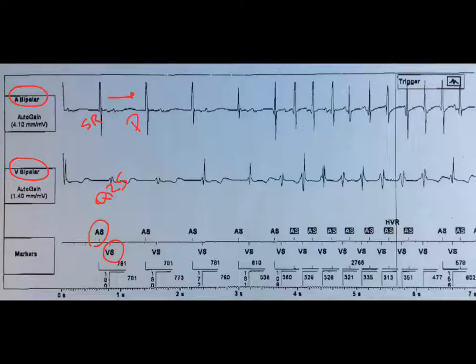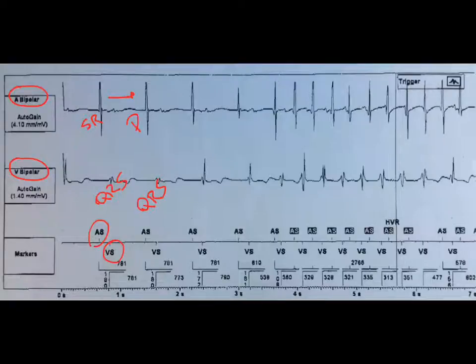This is a QRS — another QRS, V sense. How about the next bit? Another P wave, another QRS. Next bit, the same.